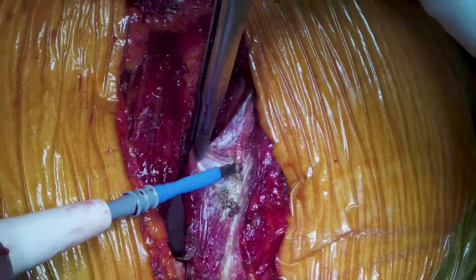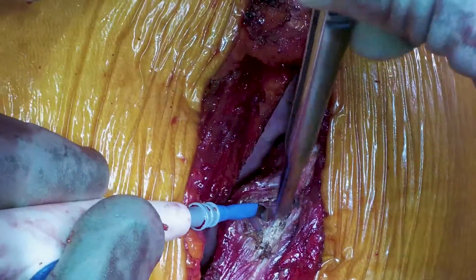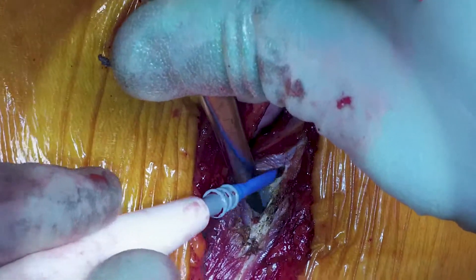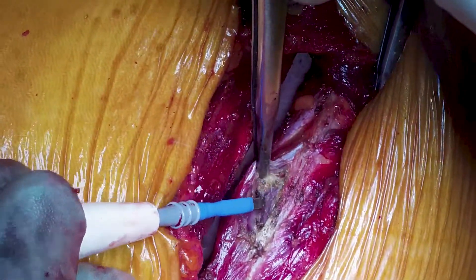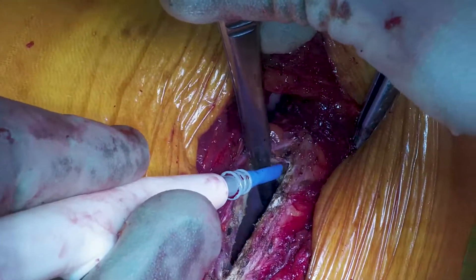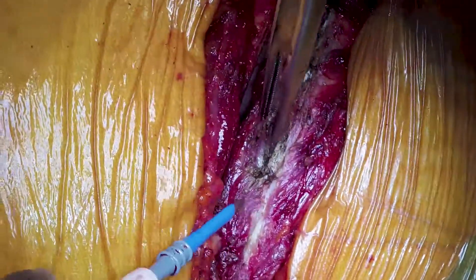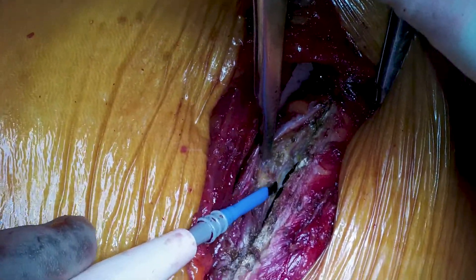This is the intercostal strip being performed — you hold it as far above the rib as you dare and angle upwards to break the pleura on the other side, making sure the nerve stays intact. The forceps are being used to give leeway and act almost as a shield against the diathermy in case of any mishaps, protecting the nerve should anything go wrong. You can just see the nerve there as Mr. Dunning points to it — it runs alongside the artery and vein. He explained that dissecting the muscle first causes it to come anteriorly, allowing much better visualization of the nerve and reducing the risk of damage.